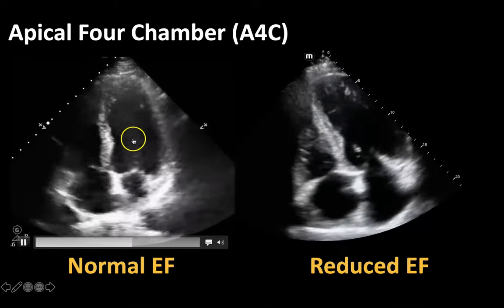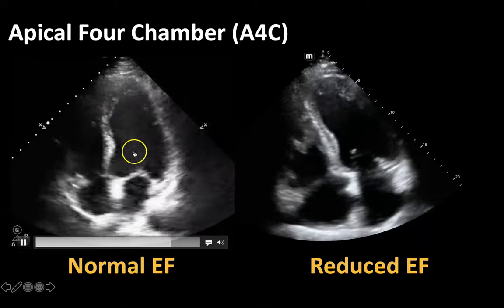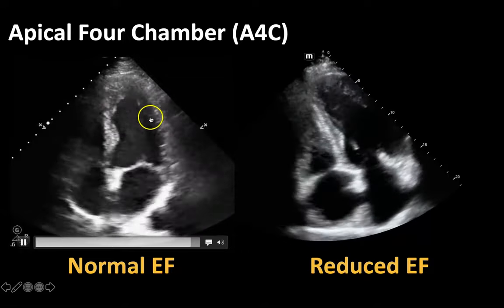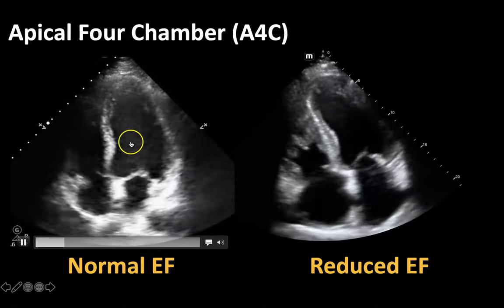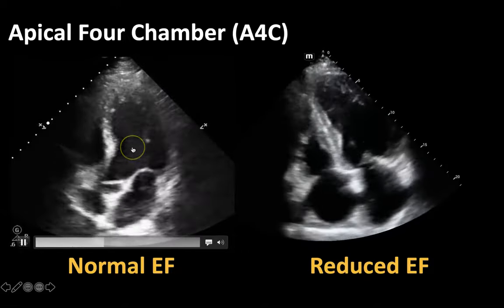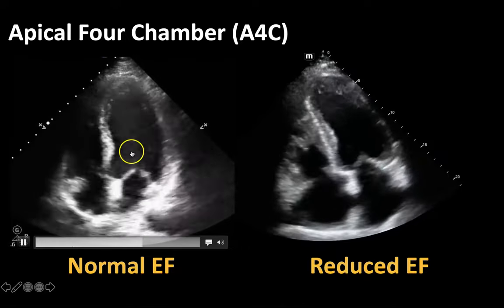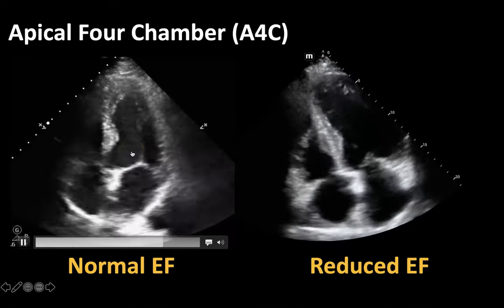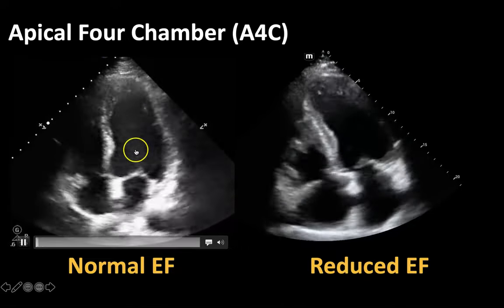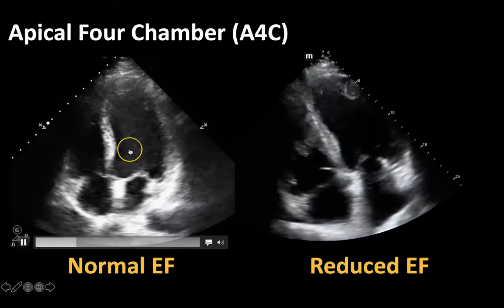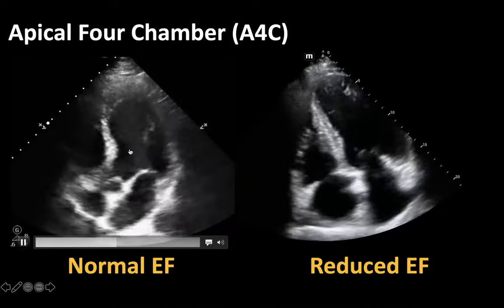Again when we're looking for ejection fraction, I want you to just focus on this left ventricle and envision this imaginary line right in the middle of the ventricle, and try to assess how well the walls are coming towards that middle. You can see here that the walls are coming reasonably close to the middle of the ventricle, and that this is a heart with a normal ejection fraction.